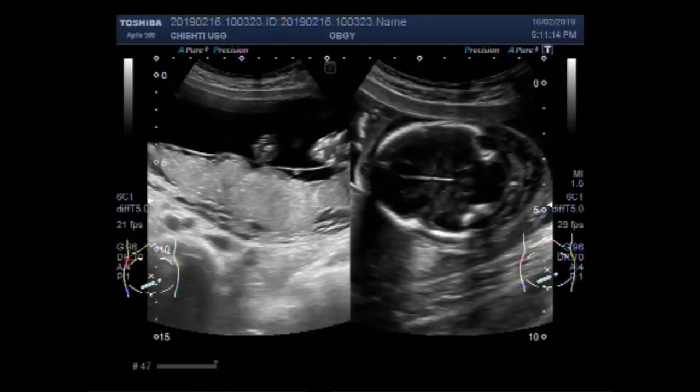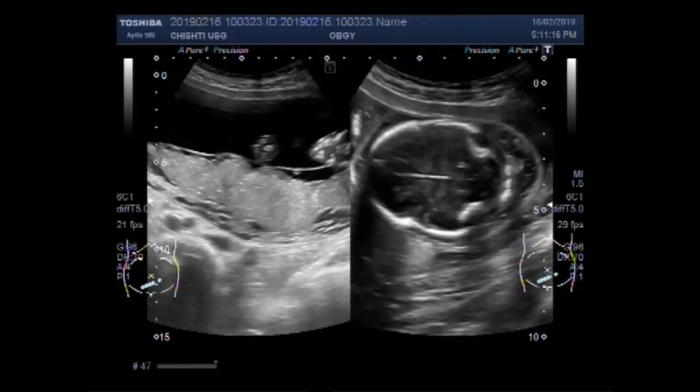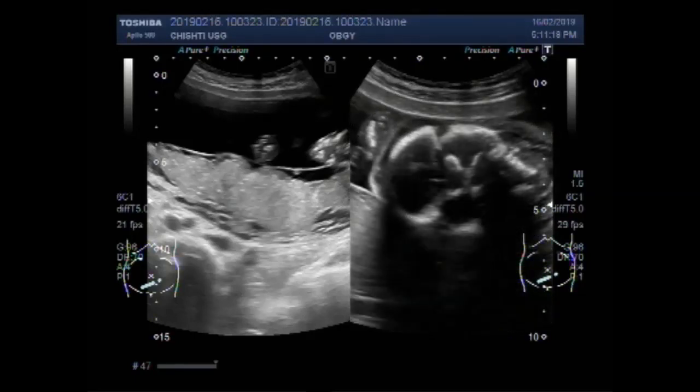This is a fetus of about 21 weeks, 5 days.